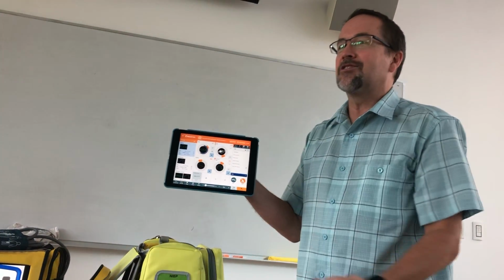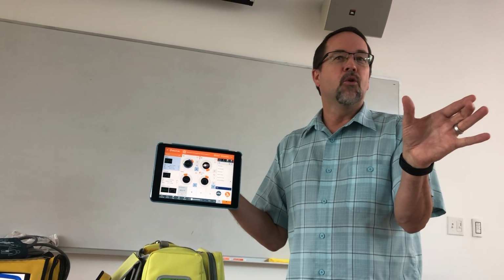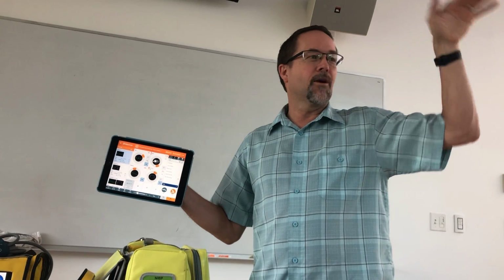So really cool, because on these little events, you can pre-program events that also have a trend time in it. Say you've got a scenario with anaphylaxis and you're hoping they're going to give epi. You can have an event that says epi administration, and you want the respiratory rate to come down this much over this amount of time. You want the bronchospasm to go away over this amount of time.